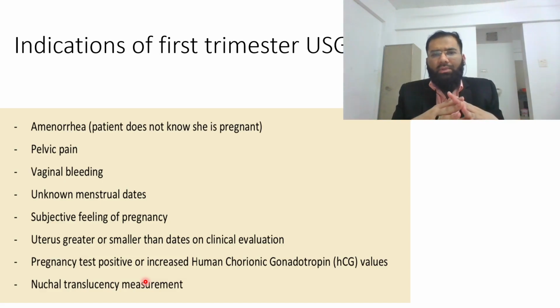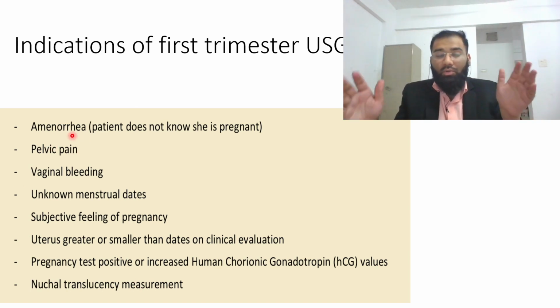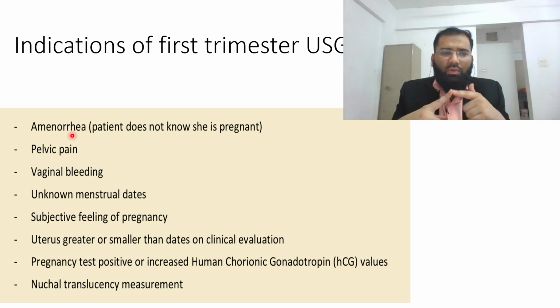What are the indications of first trimester ultrasound? So initially, patient might present with amenorrhea. She might not know if she is pregnant. UPT can turn out to be positive. So first thing is to diagnose pregnancy.